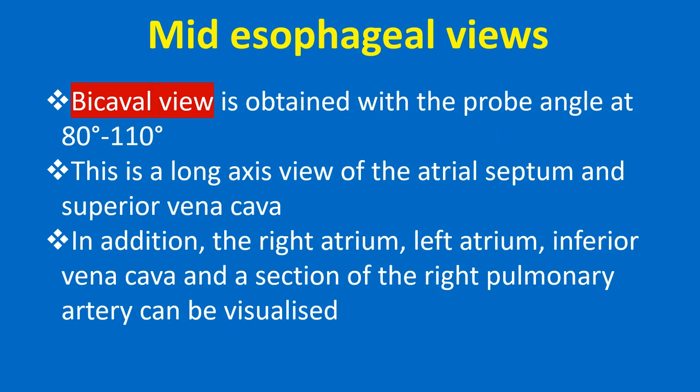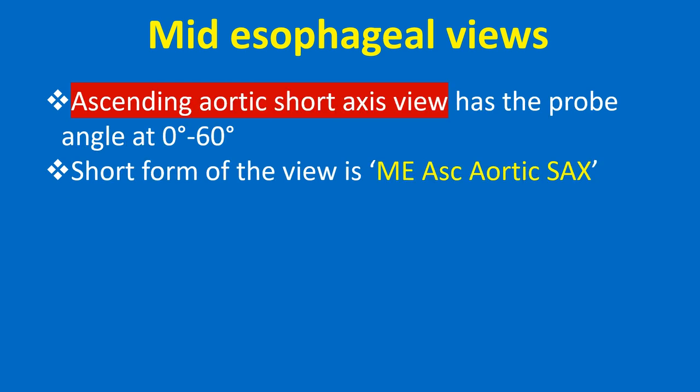The bicaval view is obtained with the probe angle at 80-110 degrees. This is a long axis view of the atrial septum and superior vena cava. In addition, the right atrium, left atrium, inferior vena cava, and a section of the right pulmonary artery can be visualized.